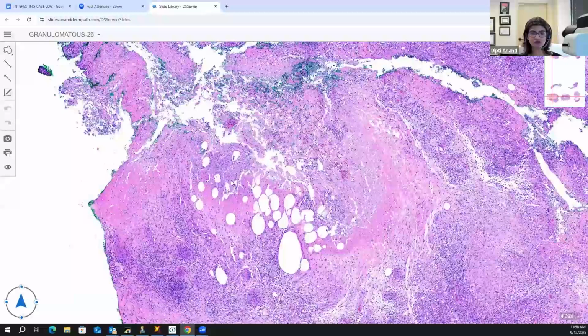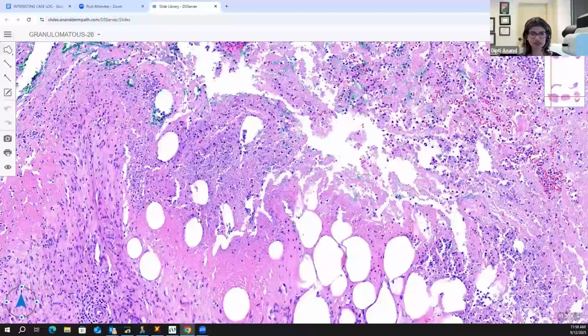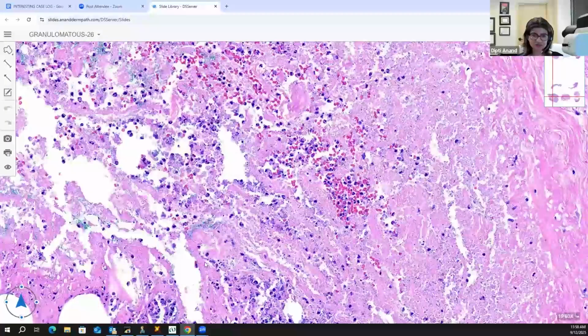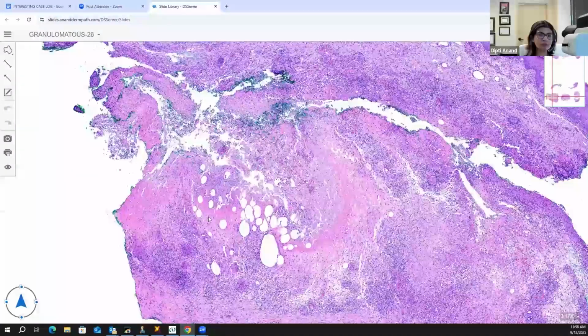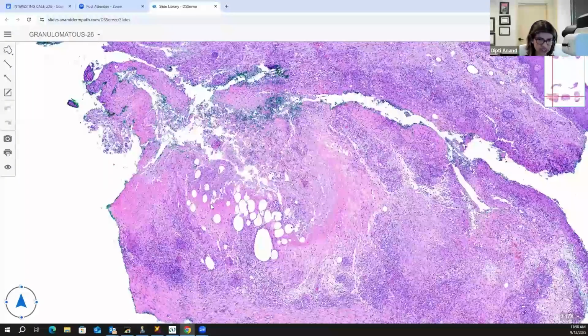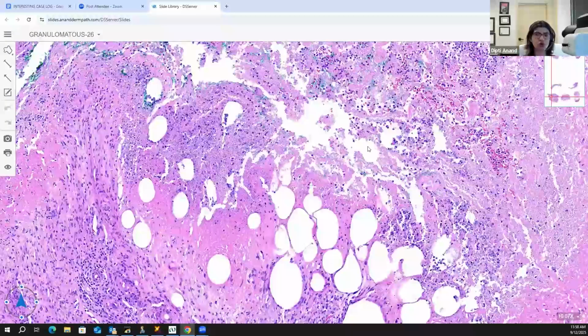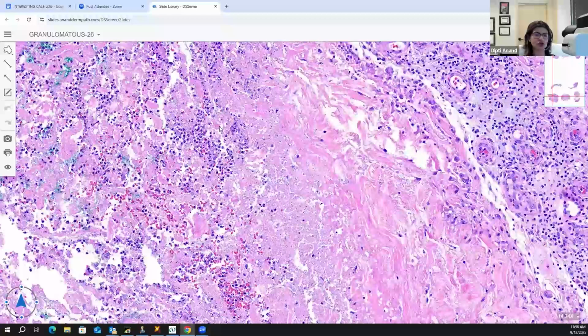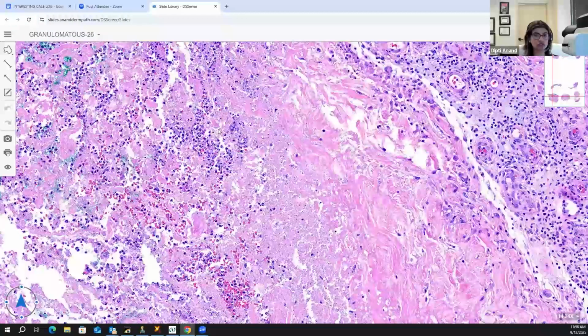When you see neutrophils mixed with this necrotic tissue, this feature right here, where you see the pseudopalisaded nature with the granulomas, which are the histiocytes, and the neutrophils, with this dirty caseating necrosis, that is in the category of a suppurative granuloma, which should make you think about an infection.